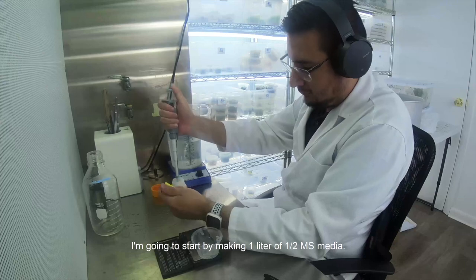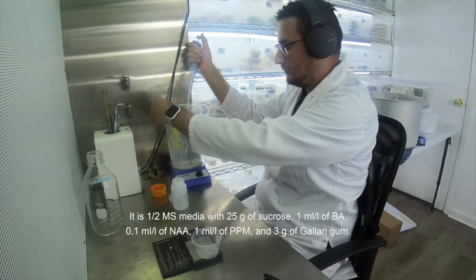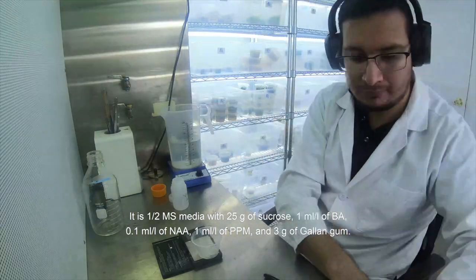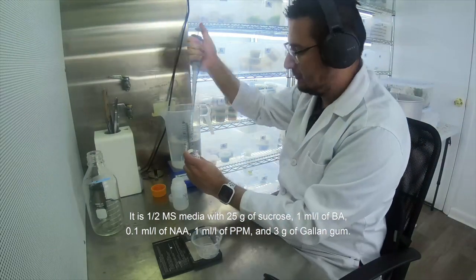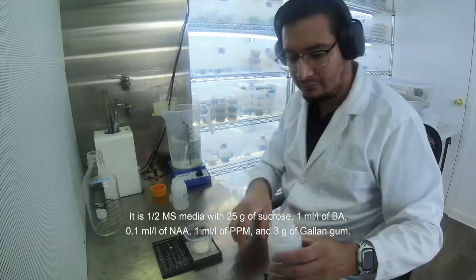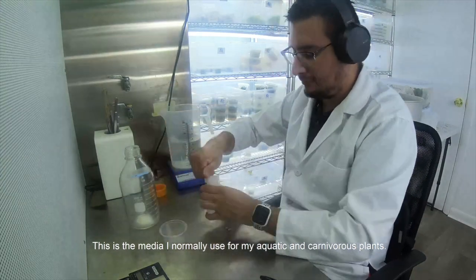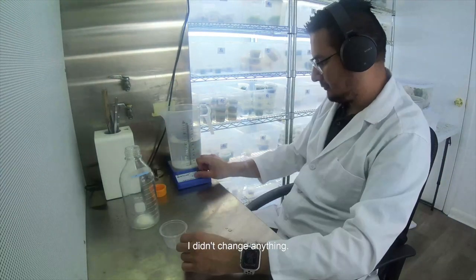I'm going to start by making 1 liter of half MS media. It is half MS media with 25 grams of sucrose, 1 ml per liter of BA, 0.1 ml per liter of NAA, 1 ml per liter of PPM, and 3 grams of Gellan gum. This is the media I normally use in my aquatic and carnivorous plants — I didn't change anything.